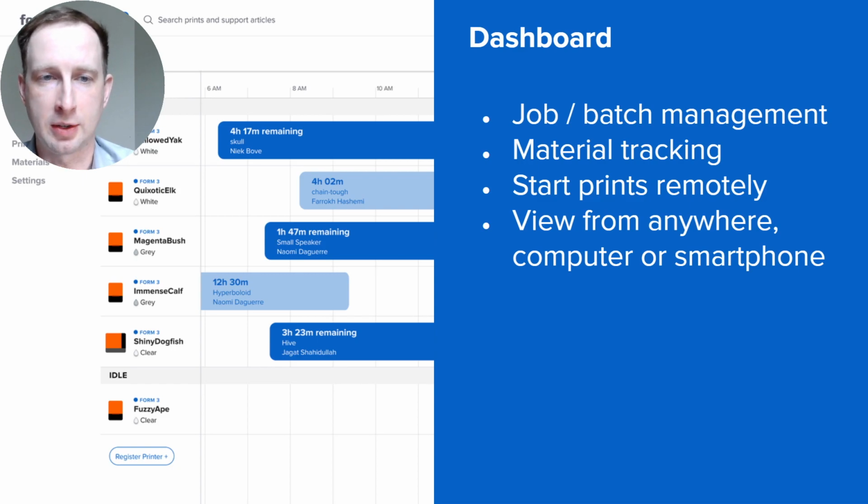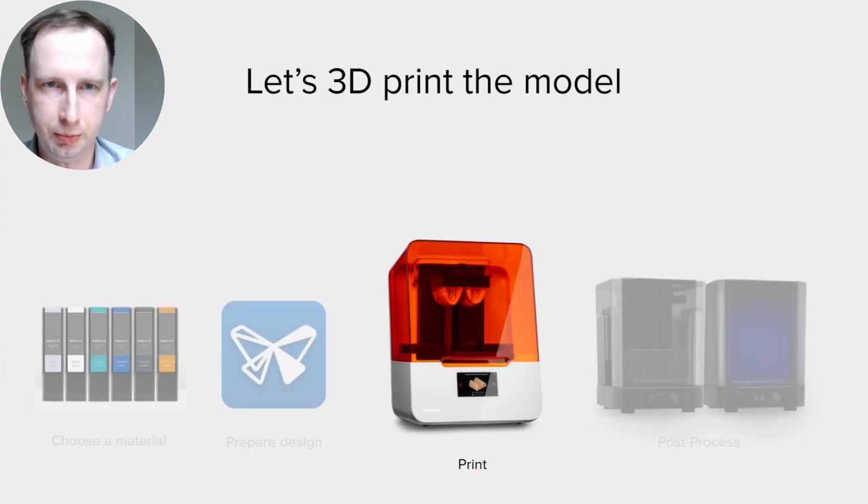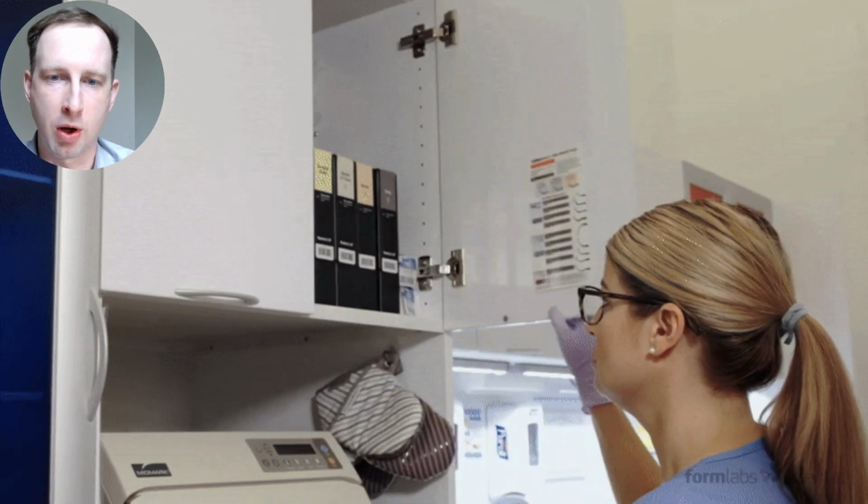Dashboard is also fantastic for this sort of remote process as well. It allows you to see your printer or printers in a really cool timeline overview, what prints you've done, how much material you've used, how much you have left. It's really a fantastic piece of software as well that will give you a lot of information on what should be done or what's going on. So with all that said, on the software side, we're ready to now 3D print the model.